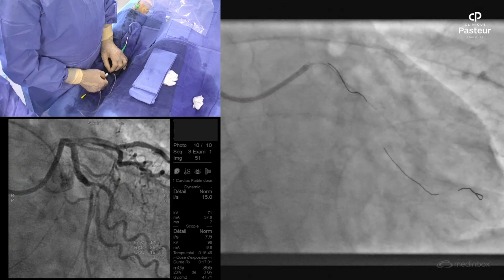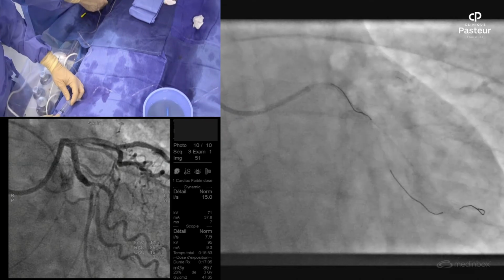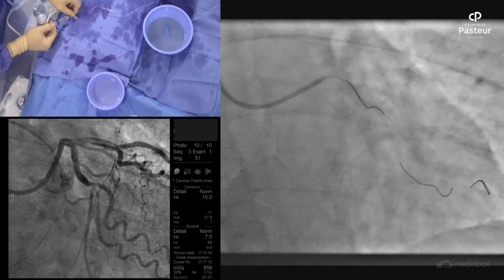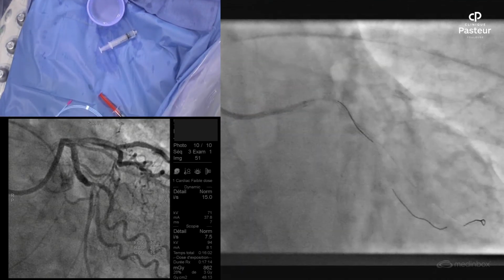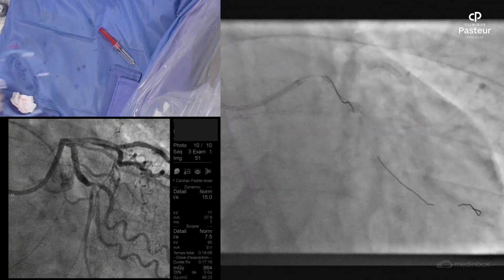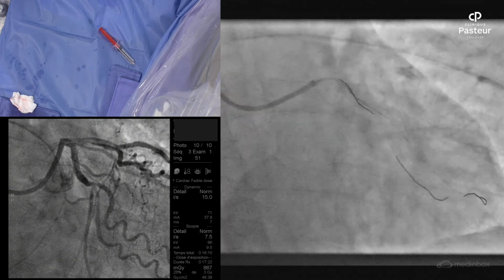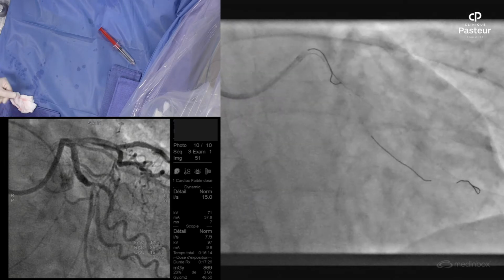And now, maybe the bend is not enough. You were able to go into the third one, not easy. Right now maybe you are at the level of the third one, but let's redo it.